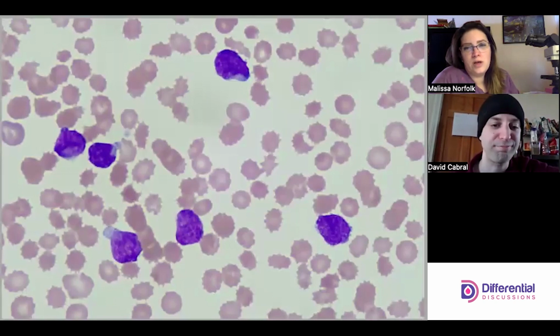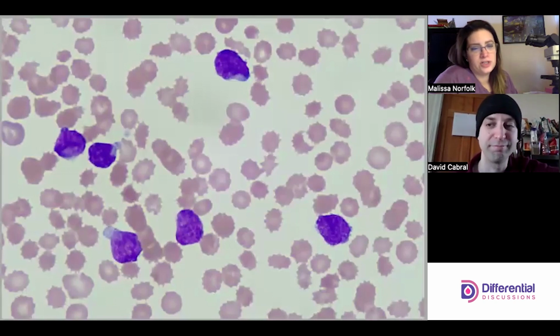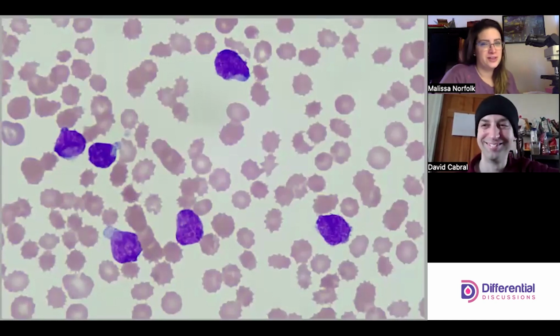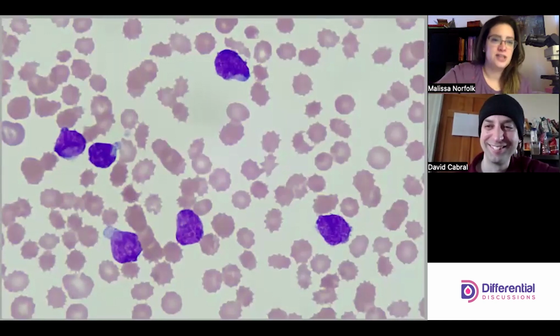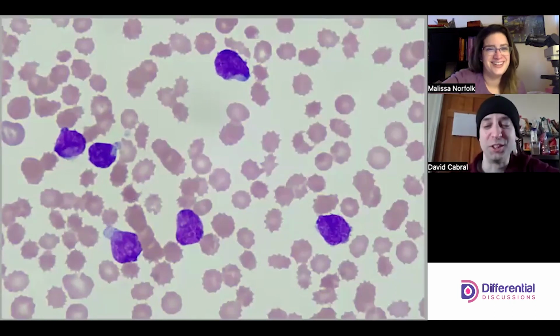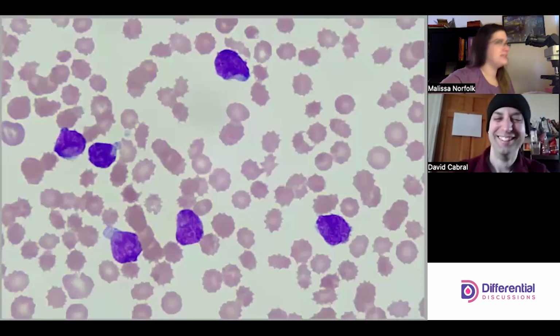Once you're actually working on the bench, you'll get to know the patient population, because each patient is going to have slight variation to their cells, and you'll say, oh, this is Joe Schmo's blasts. It might as well be the person's face to us, right? Exactly. We can tell by their cells.